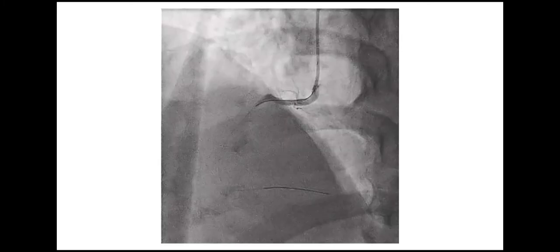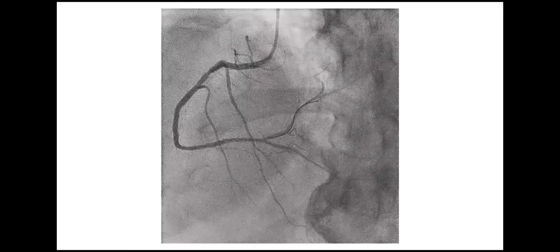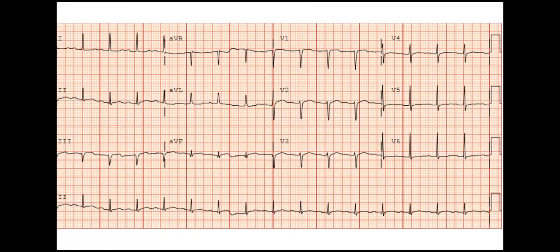Actually, with the dopamine, the sinus node came back. It was sinus tach, as you can see. And then the patient's EKG came like this. I don't think it was the dopamine, it was the vessel opening up that did it. Both ways, yes. But now the question is, what do you do now?